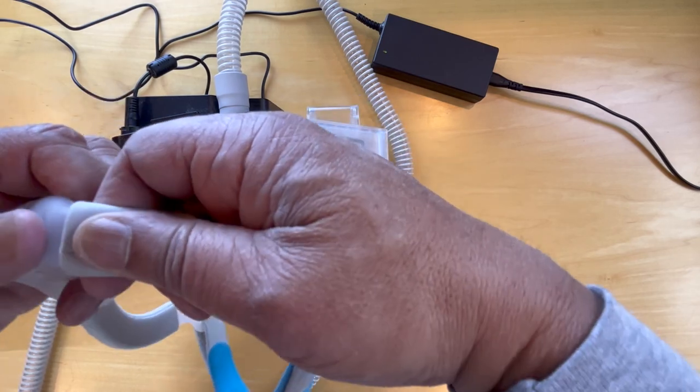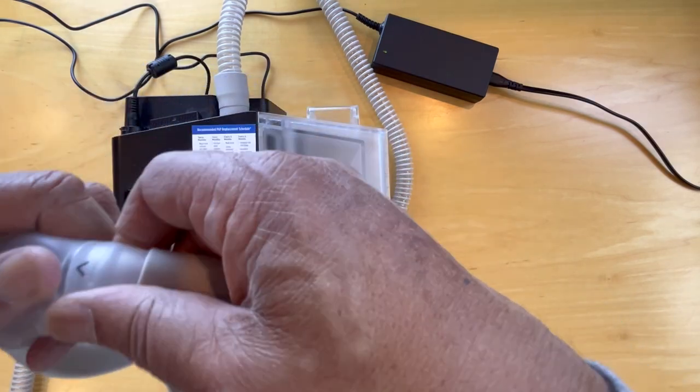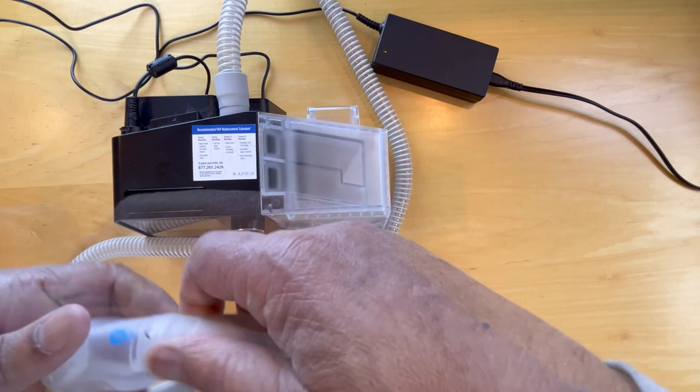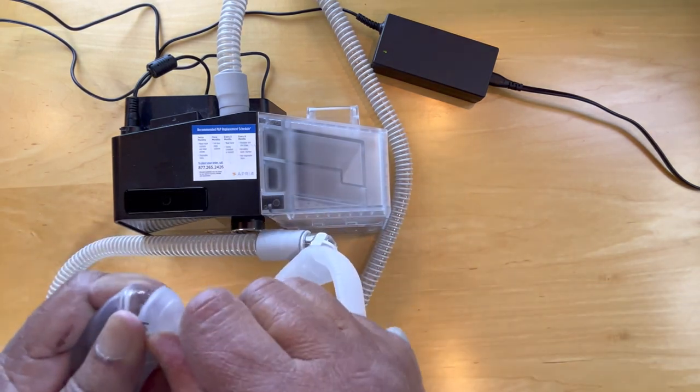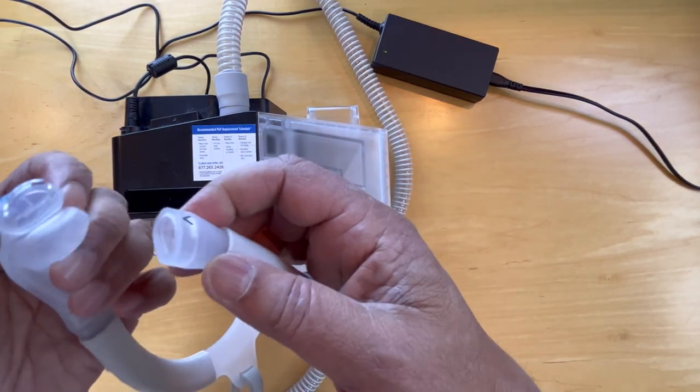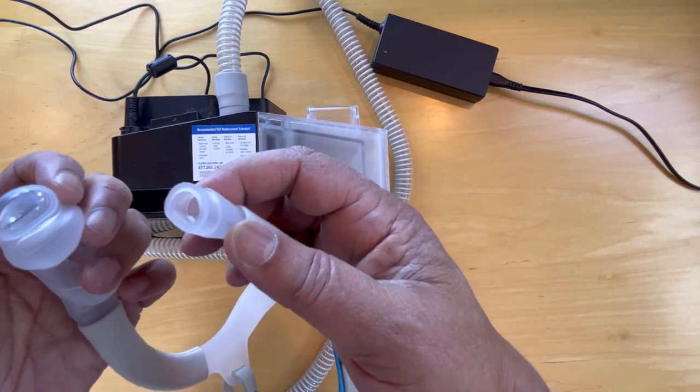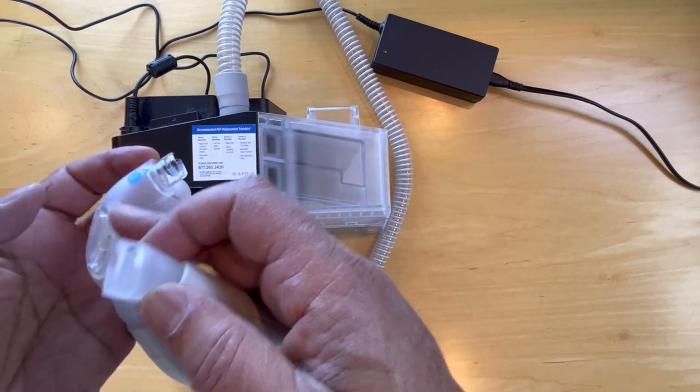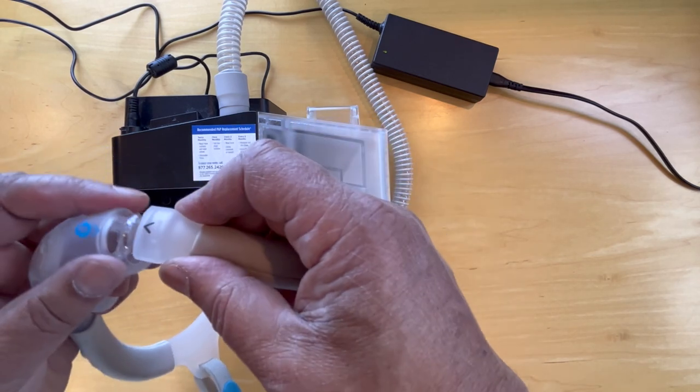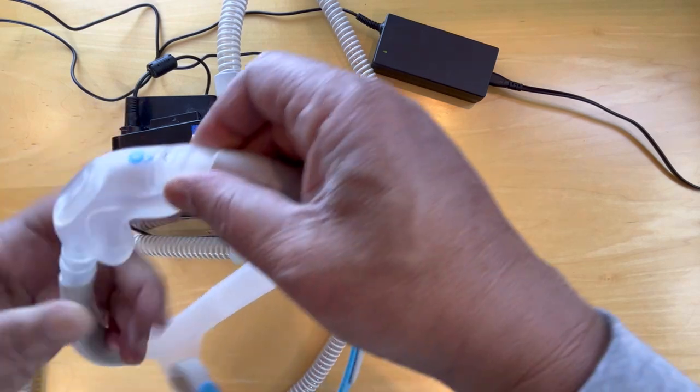So to replace that you need to pull this off here. There we have it. And so if you replace this with a small or a large you would come back and clip that on right here.